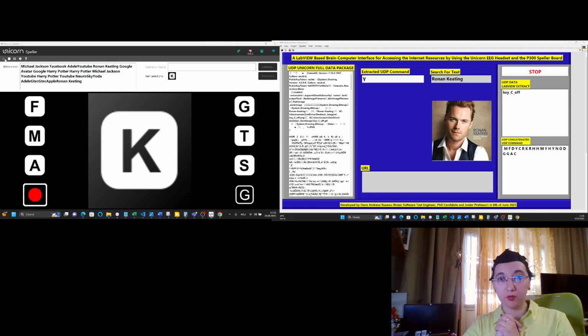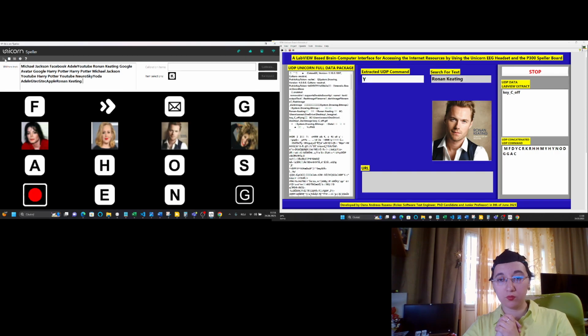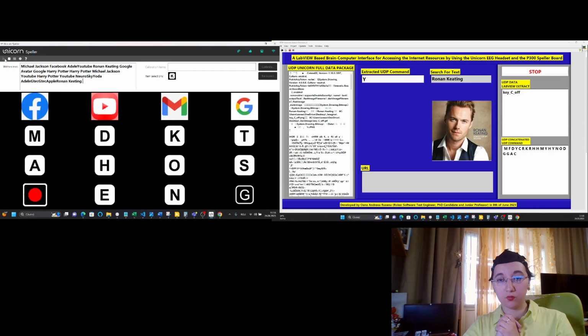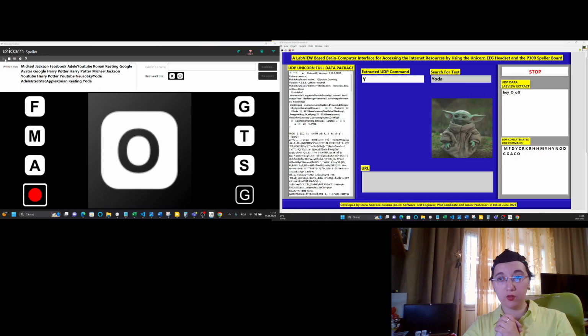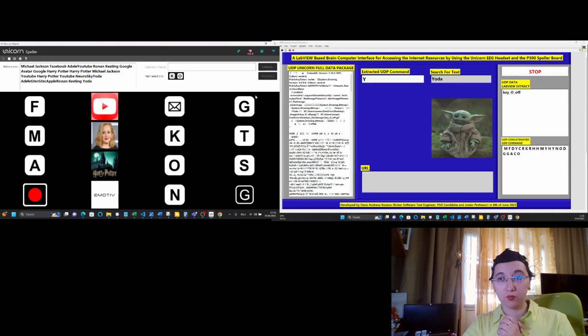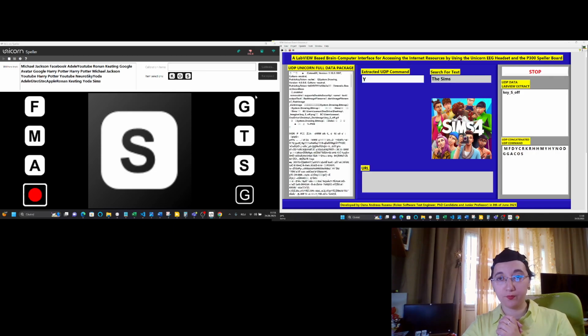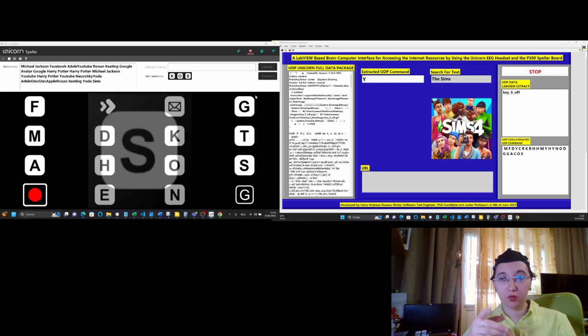Okay, another mistake, but we need to continue. Now Yoda is selected and now I'll focus on Google, this one. No. Again, Yoda and Google.